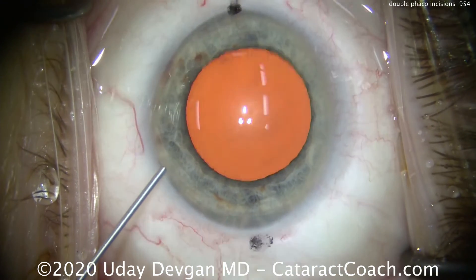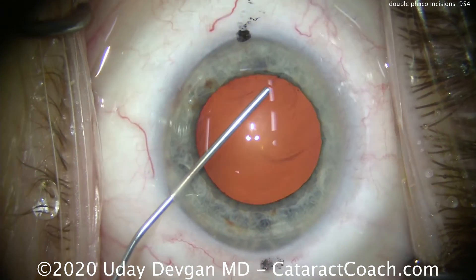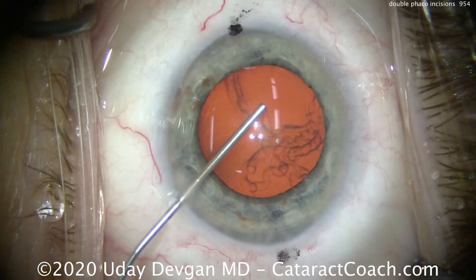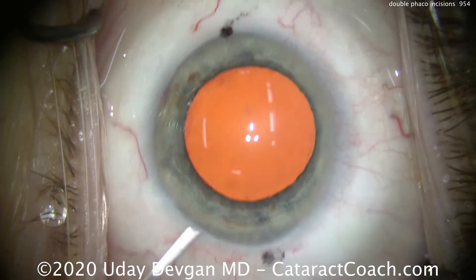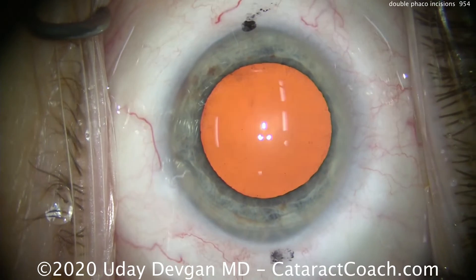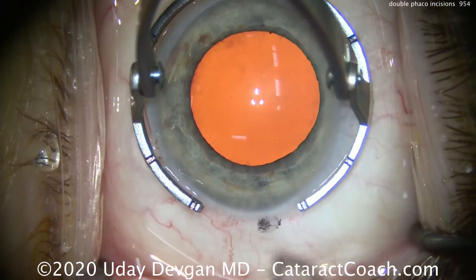Now here comes the dispersive viscoelastic filling up the anterior chamber. Make sure you get a normal physiologic pressure — if the AC pressure is very low, your tunnel length will be longer; if it's very high, you'll get a shorter tunnel length. So you want a normal physiologic pressure.